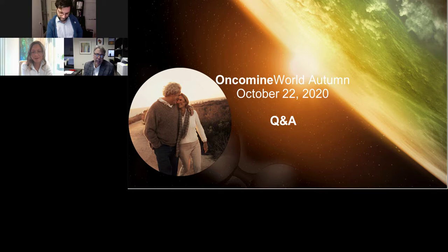And you can do NGS assays where you can detect obscure fusion partners too. So I think it's nice to get away from FISH. It uses up a lot of tissue. It's very technically challenging. Depends on how good your lab is, how good your cytogeneticists are at making difficult calls. And it's a very powerful approach. So I think, if anything, it truly complements it and is a real workhorse in the lab.